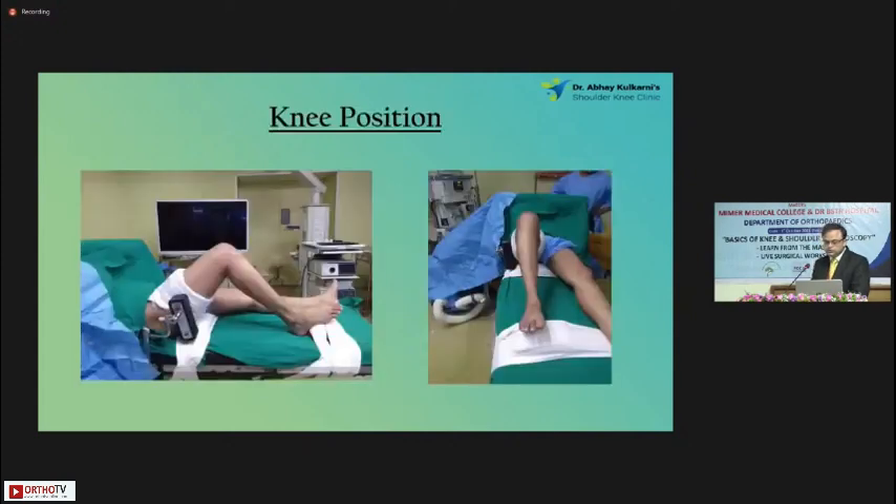This is a position in which I do most of my knee arthroscopies — it's the supine position. There's a block at 90 degrees and a lateral support. A small modification is that I also keep a small one-liter bottle just under the tourniquet. That gives me a very good position. Whenever I put the knee outside the table, I get a good 90-degree position of the knee.